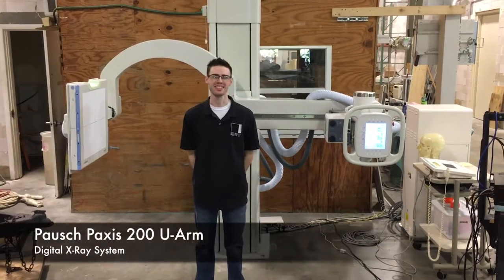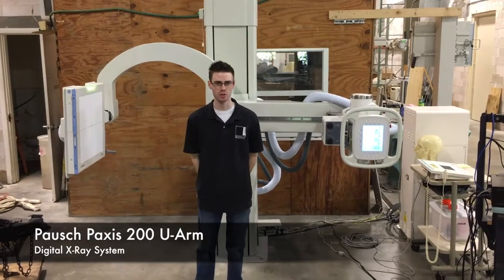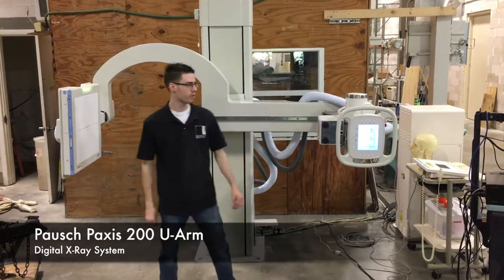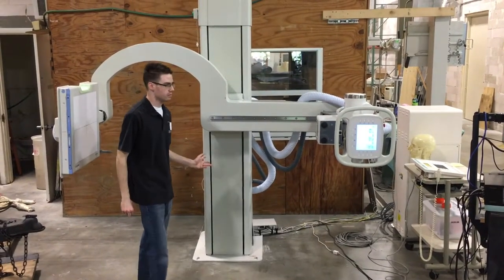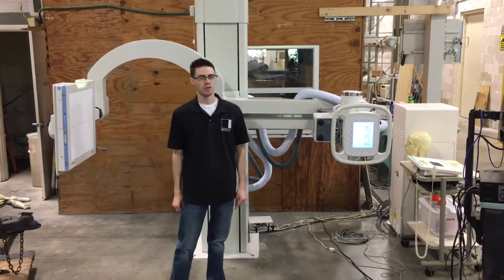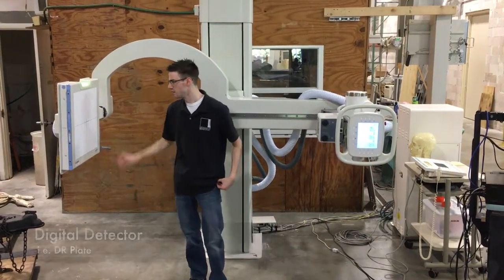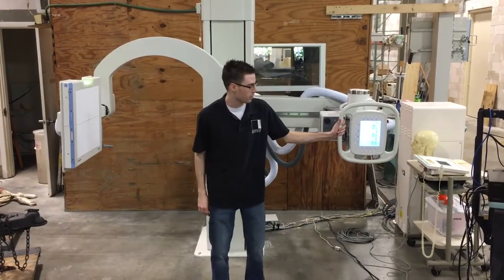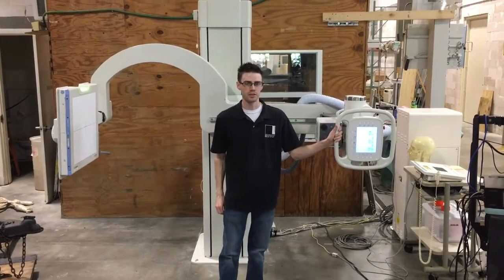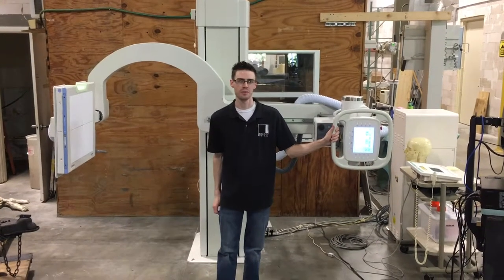Hi, my name is Andrew Hines and this is Integrity Medical Systems. Today we are going to show you the PAXS 200 E-WAR. This is one of the most versatile x-ray tube stands out there. It can do any position manually or it can be called up automatically. It uses a digital detector plate and a touch screen control panel, from which you can automatically position the U-Arm. Today I'm going to show you how it can be positioned and how to make an exposure.